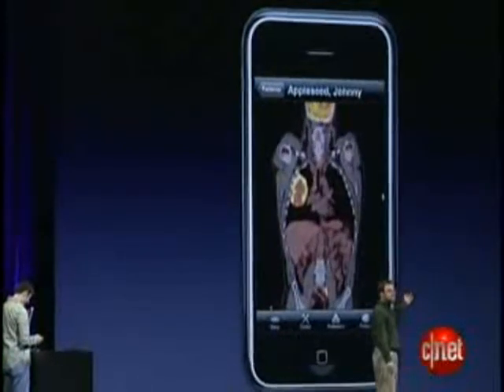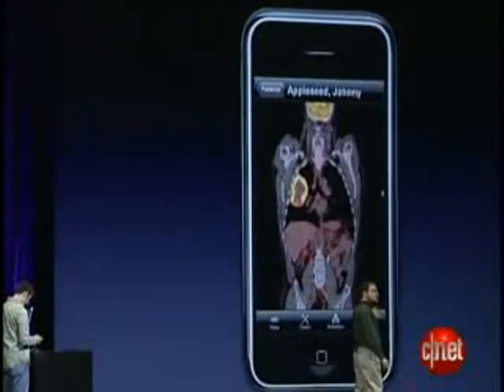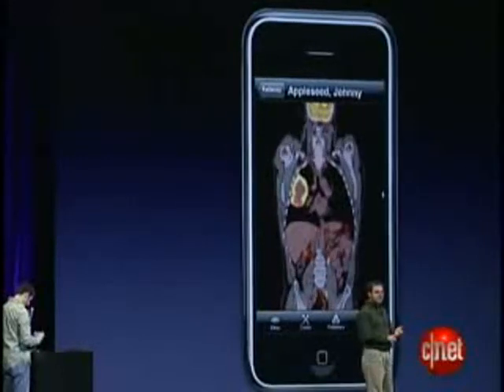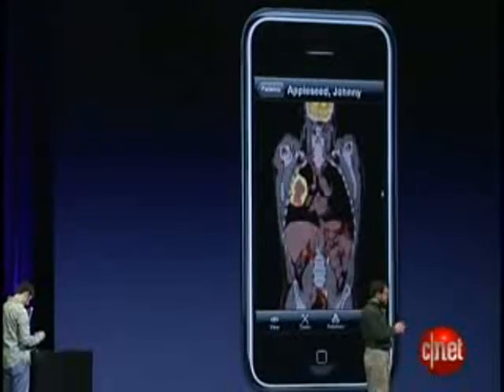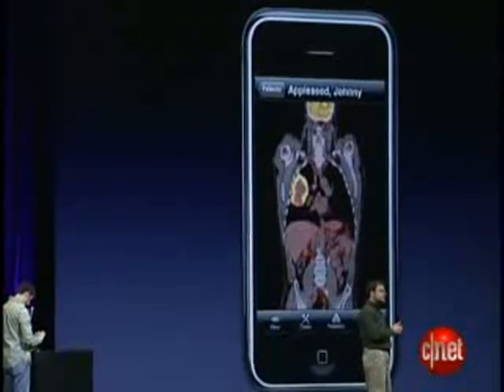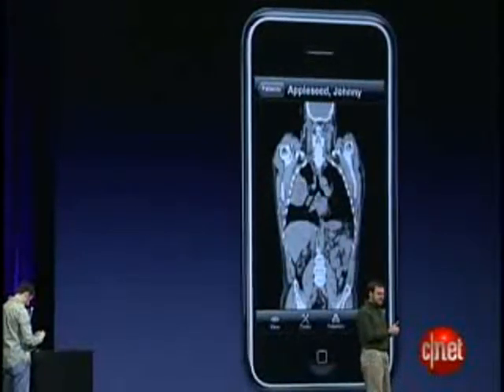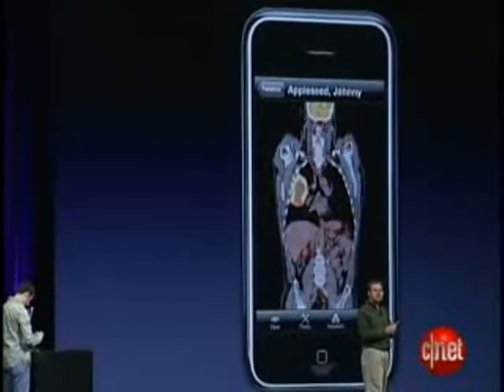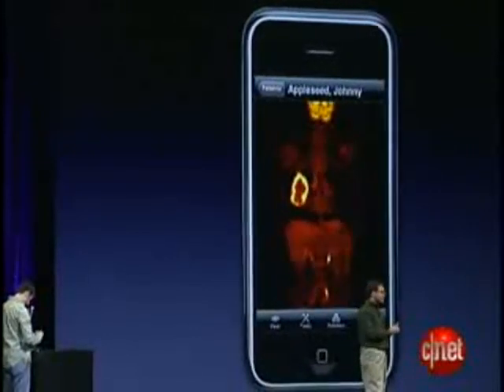Right now we're moving through the slices of a fusion study with a one-finger slide, where we have a CT scan showing anatomic data and a PET scan showing metabolic activity.